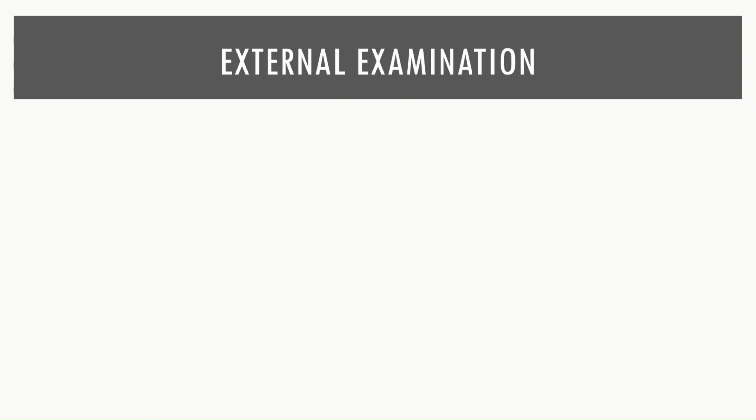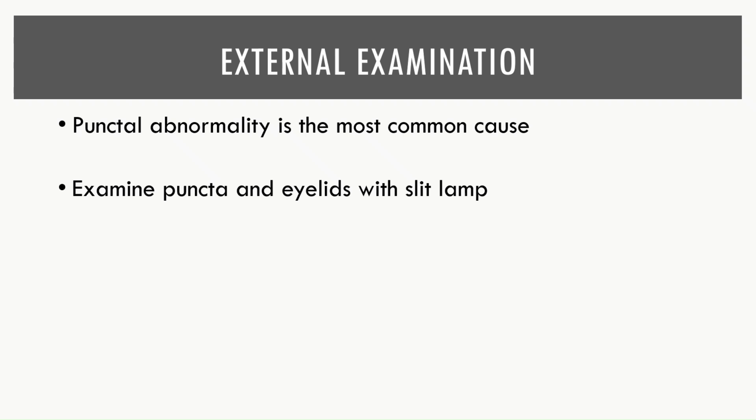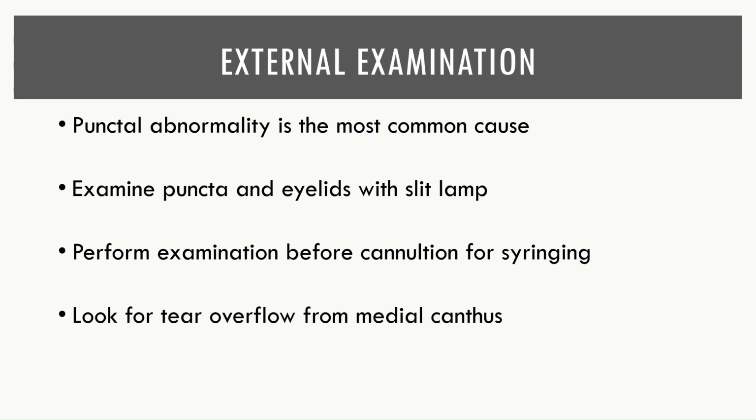External examination is crucial. Punctal abnormalities are the most common cause of lacrimal drainage failure. The puncta and eyelids should be examined carefully on slit lamp before any manipulation. Observe for tear overflow from the medial canthus and any mucopurulent discharge.